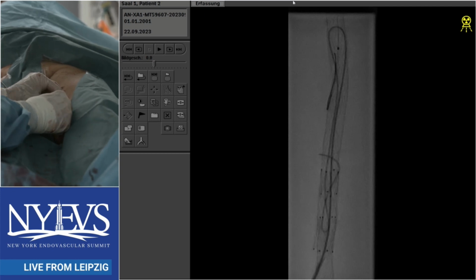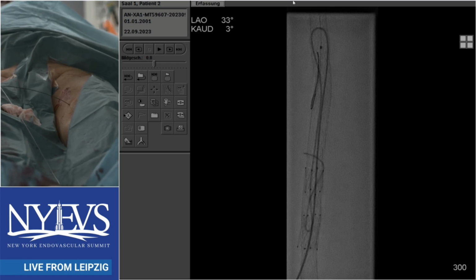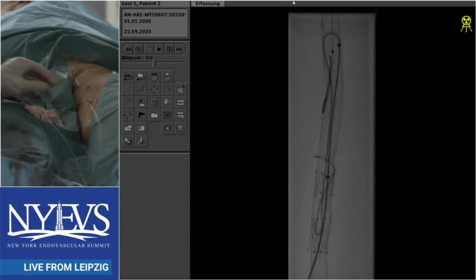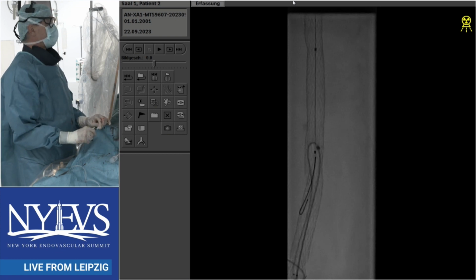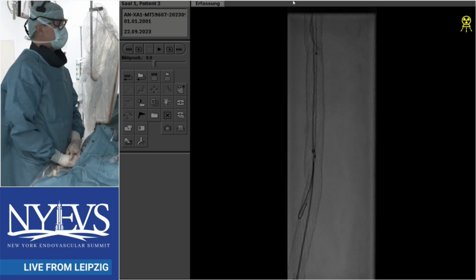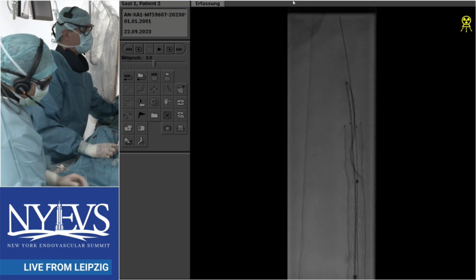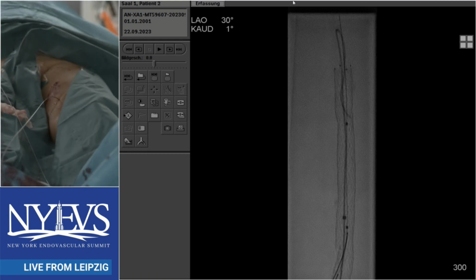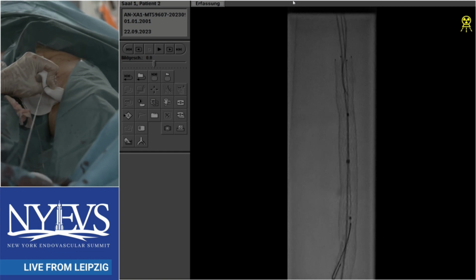If I could ask the panelists, this is a tough cross. This is not the typical ISR case we see with a lot of acute thrombus that's easy to cross. So the question becomes, when you do cross, is the Rotarex device going to cross? What's been your experience, Jos or Andre or anyone on the panel? I think the chance that it crosses is high. It may need some kind of predilation, indeed, that's true. But eventually, I think it will work. Yes, stent fractures could be a problem, sometimes around a stent fracture it can be unsafe.